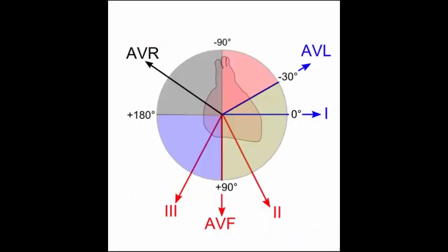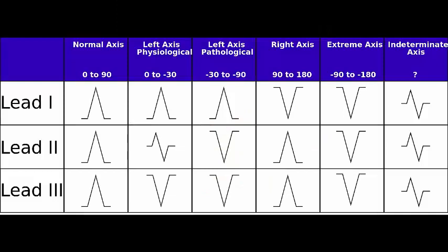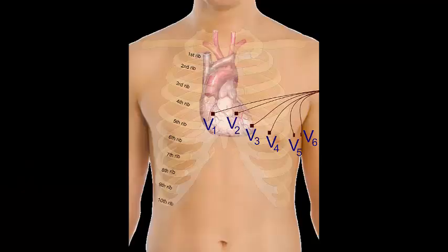If the average frontal cardiac axis vector lies between minus 30 degrees and plus 90 degrees, we presume it to be a normal axis. The cardiac axis may vary between normal individuals from minus 30 degrees to plus 90 degrees depending upon their posture, electrode placement, shape and size of their chest, deformities of ribs and spine, etc. If the axis lies beyond the normal range, we need to look for causes of abnormal conduction or abnormalities in heart chamber sizes.